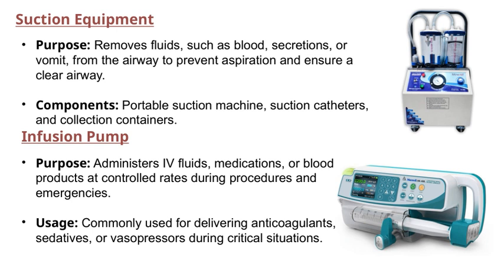Moving on to infusion pumps. These are vital for administering IV fluids, medications, or even blood products. The main advantage of an infusion pump is that it allows us to control the rate very precisely, which is especially important during procedures or emergencies.